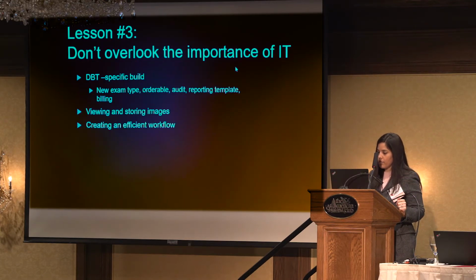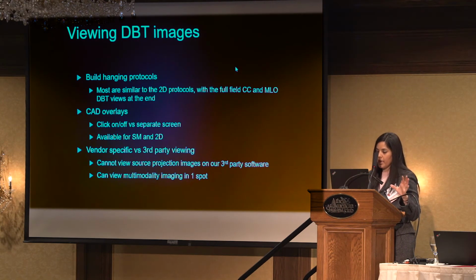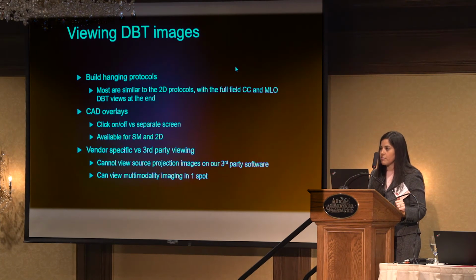IT, again, is important. We talked about you need to develop a system and an infrastructure. Make sure you spend the time to develop a hanging protocol that works. It takes a little extra time on the front end, but it saves you time and efficiency on the back end. You can choose to have CAD automatically display, or you can choose to add CAD, which is available for synthetic mammography as well as the 2D mammograms, regardless. And the CAD charge, as we know, is billed regardless of whether you use it. It's included in the CPT code. And again, you choose whether to go with a vendor-specific workstation or a third-party viewing station.